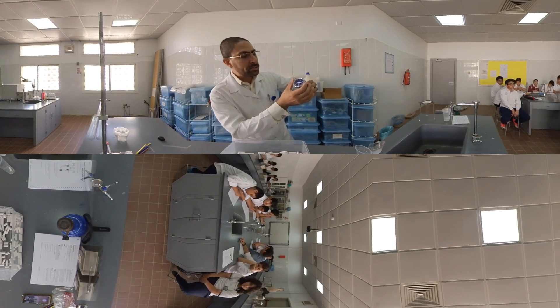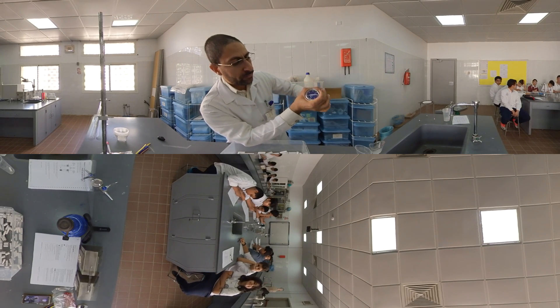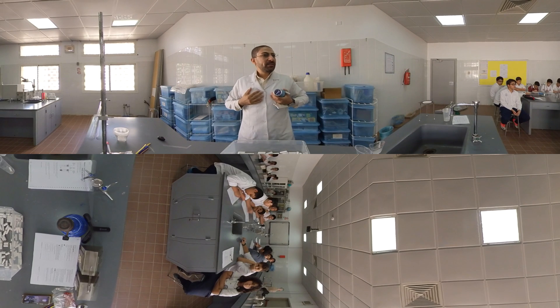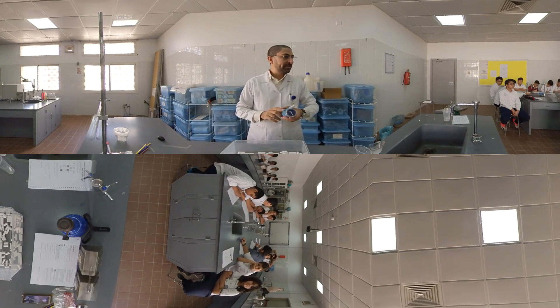First, you have to return the spirometer to zero. After this, you will take a long, deep breath and then exhale it fully, all the way to the end.